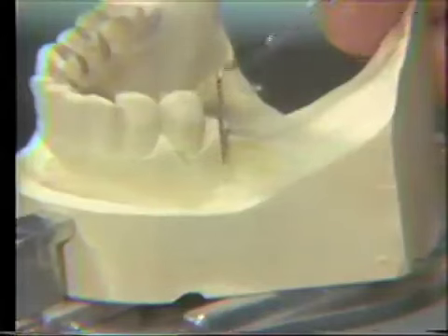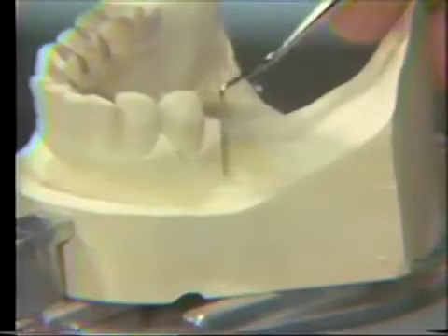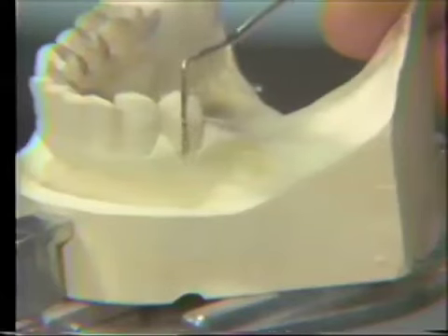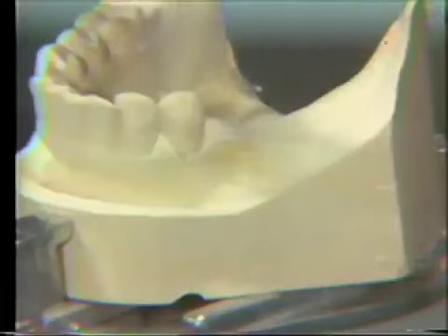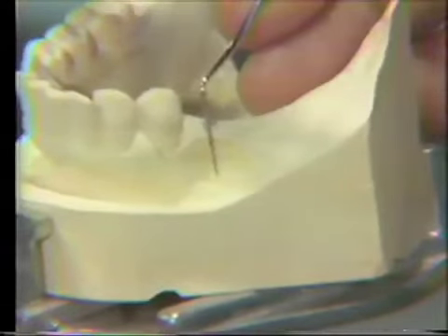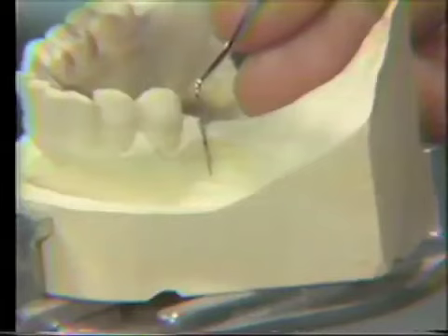If I try to tilt the cast to get around that undercut, I'm going to change all the desirable effects that I have on the hard structure, the remaining teeth. All their curvatures will be for naught, just to get around this one undercut on the soft tissue, and it's just not enough to warrant it.